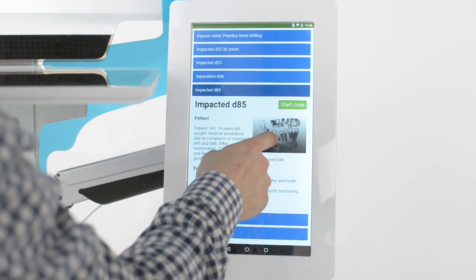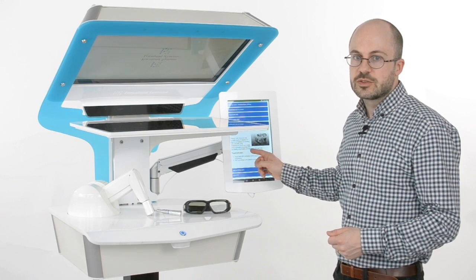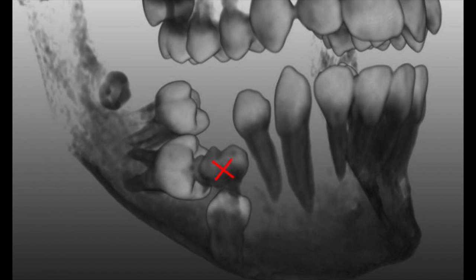It turns out that this impacted tooth is in the way for the others to erupt, so we have to remove it. In addition, we have to remove this tooth as well.